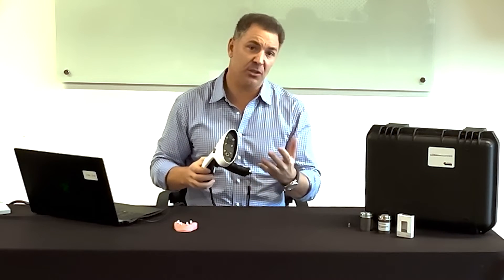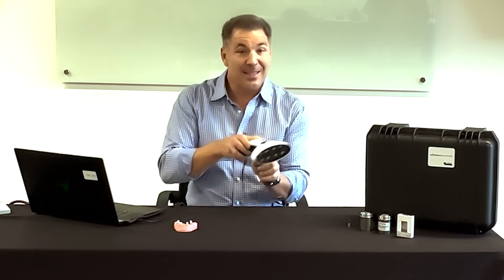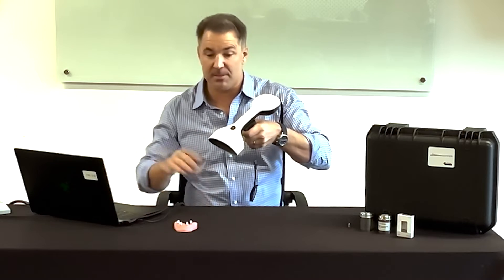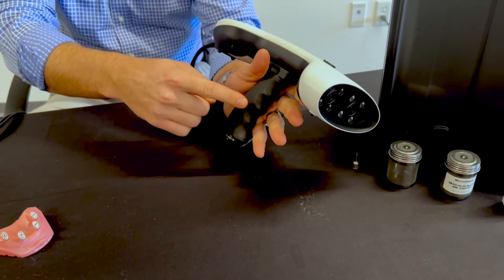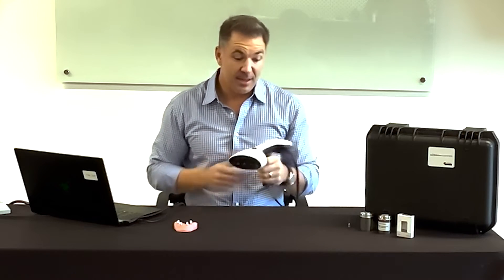Anytime we come into an office for training, we'll have the pistol grip holder on the camera. This helps when you're looking at the patient's mouth or at a computer — you can handle it with one hand. It has a finger slot so your fingers fit in very firmly and snugly, so you're not worried about dropping it. Again, it's very light, so it's not an issue.